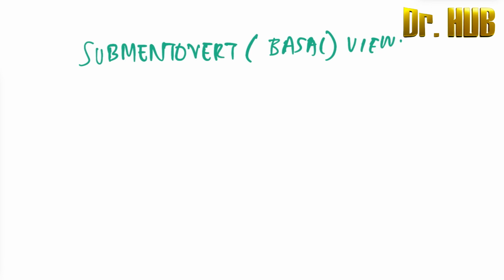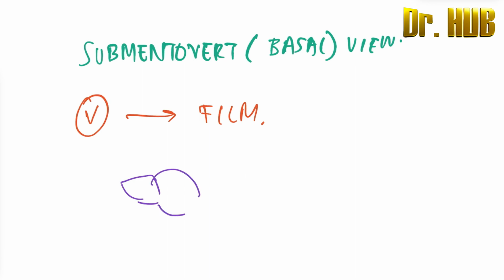Assuming this is the skull, the X-ray beam is projected at 90 degrees to the submental area.